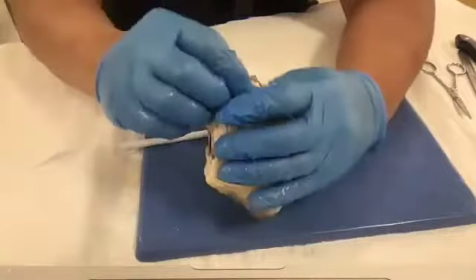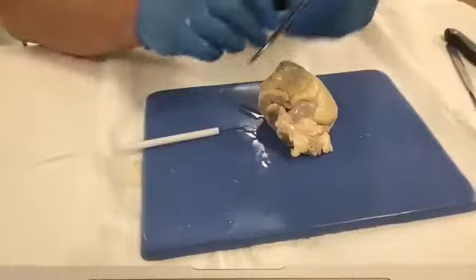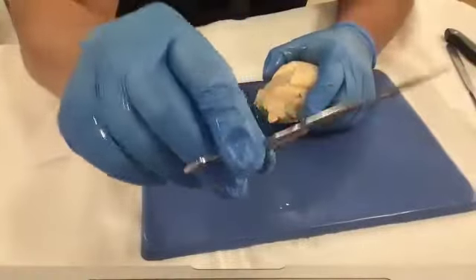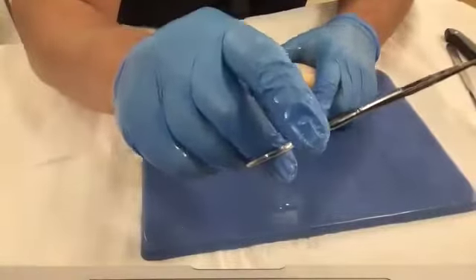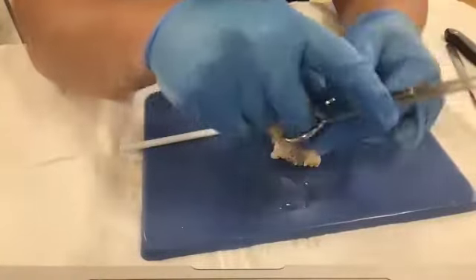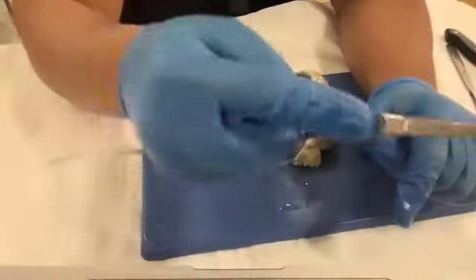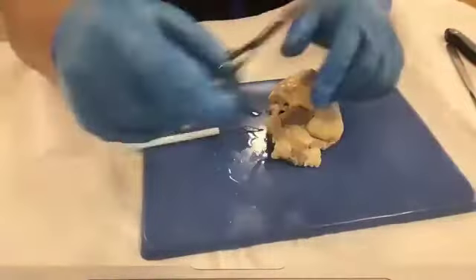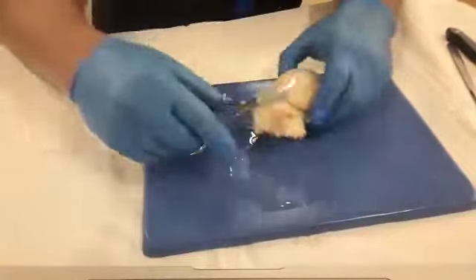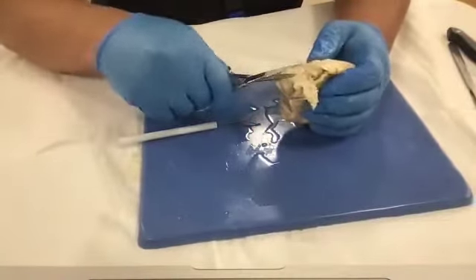Now, if you are feeling up top here, you will look at here, and let me clean up some of these spots. This is, of course, your straight scissors. The way you hold your straight scissors is put your first digit in one hole, the other third digit in the other one, and your second on this part here, it's called the fulcrum, so you can have full control, okay? Because if you just hold it like this, it's kind of hard to control. So let me just cut away some of this fat.